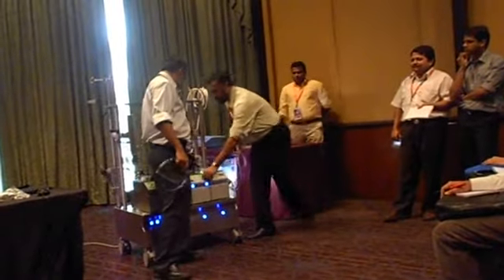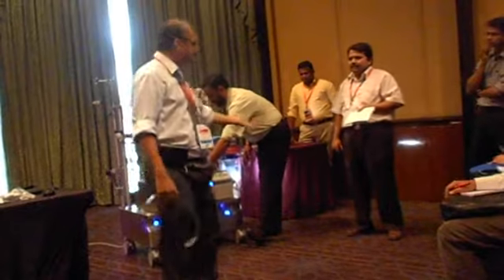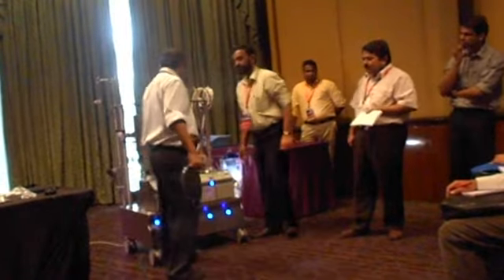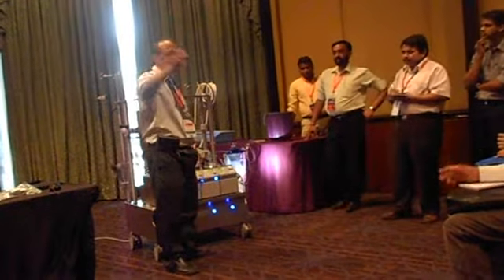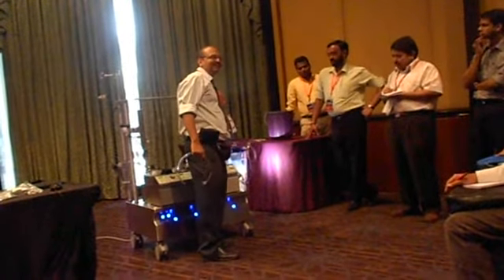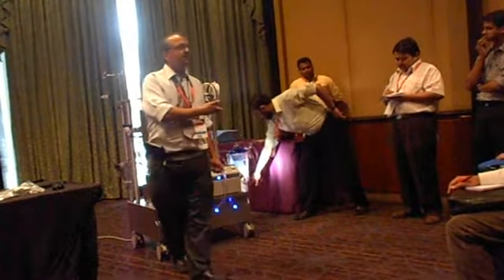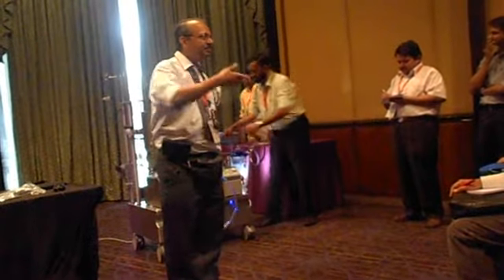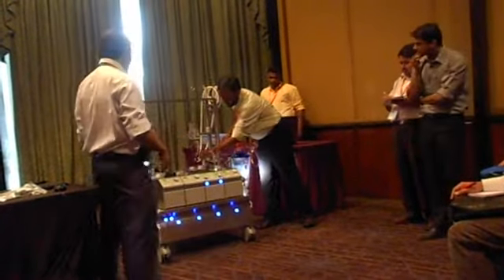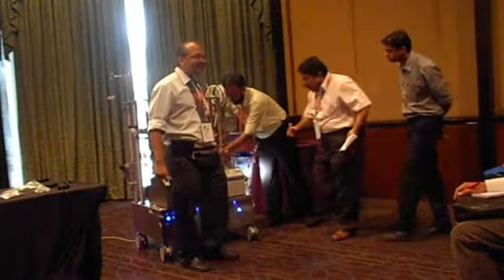What you do is take one of your pumps, a compressor. Which is a compressor available for you? One of your pumps. And take one of the suckers, open it to air, connect it to the gas inlet. Understood? You have oxygen all around you. Use that. Pump air. Here there is no oxygen. You just put a line to it, connect it and run it here.